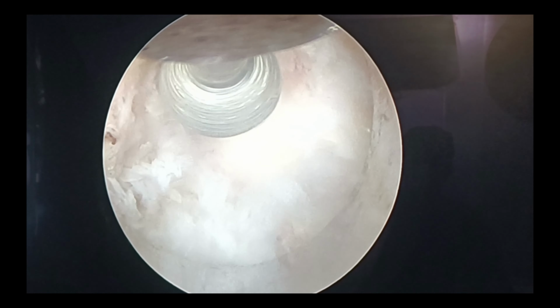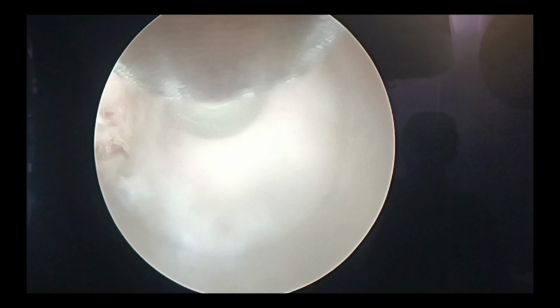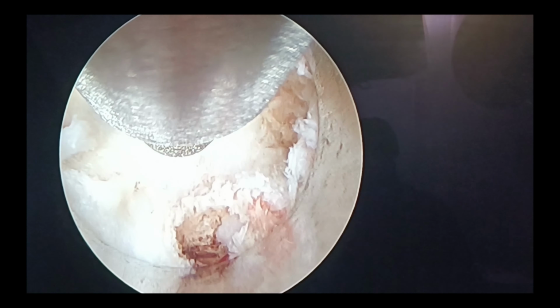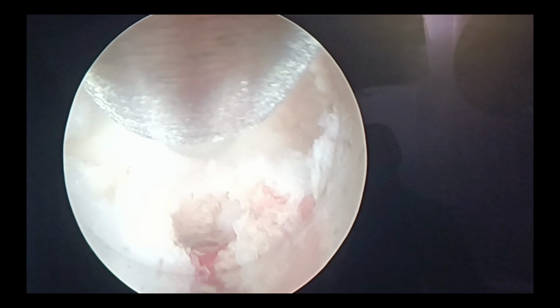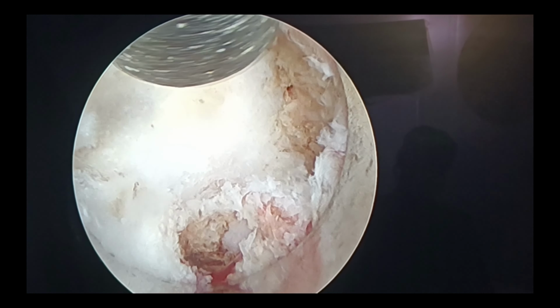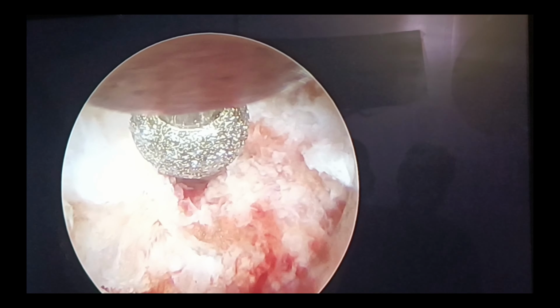So as we continue, we get some space, and our orientation becomes little better as ligamentum flavum starts appearing. In dorsal spine, anatomy is much different than what we usually find in lumbar. In dorsal, usually facets overlie each other, so that's what we will also show here in this video.